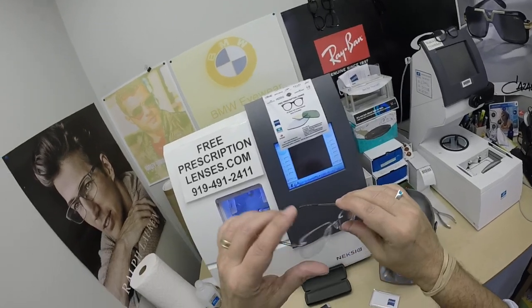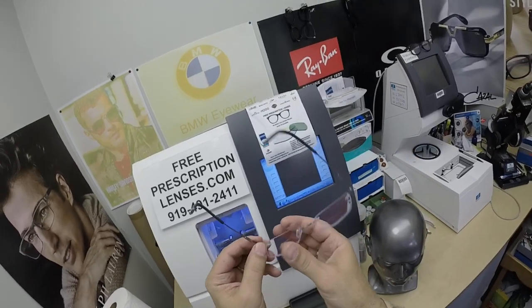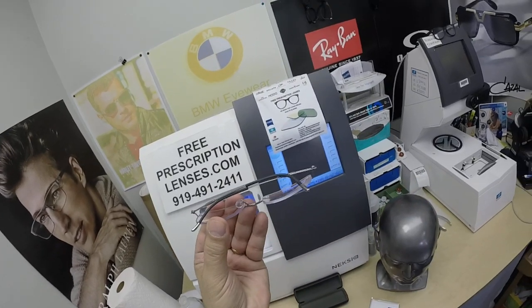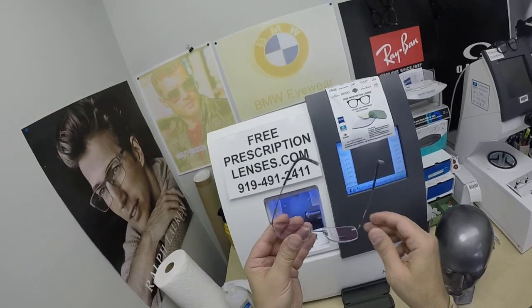This frame is titanium — of course Austrian made. All Silhouette frames are made in Austria. There's the memory metal titanium, and this is the traditional titanium that also happens to have the traditional hinge. If you want to put your glasses on with one hand, this is the one to do it with.